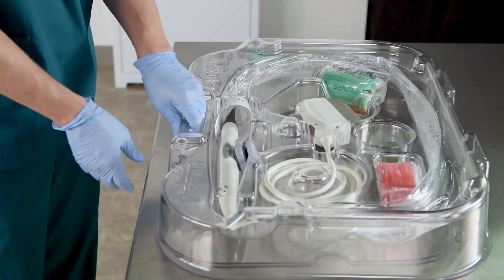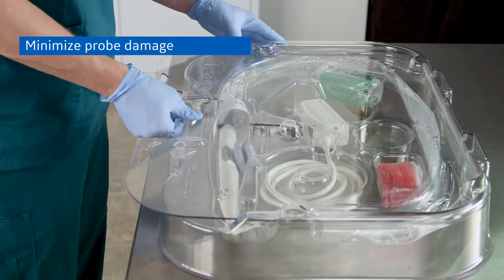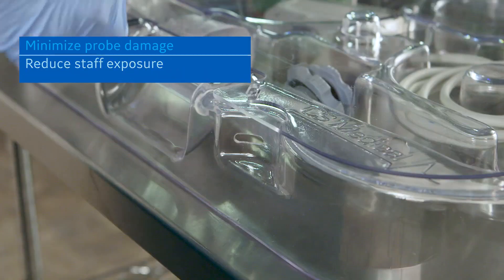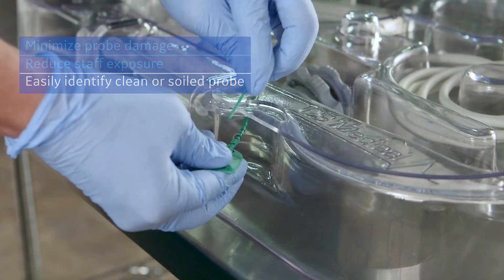The T-Porter is designed to transport TEE probes. It helps minimize the risk for probe damage and provides a barrier to soiled TEE probes, reducing staff exposure to hazardous material. It uses a green tie band to indicate that a probe is ready to use, or red to identify a soiled probe.